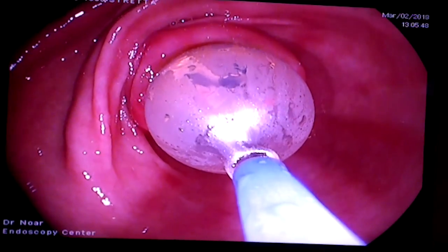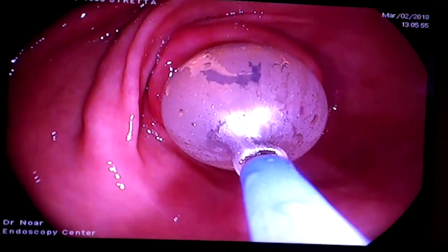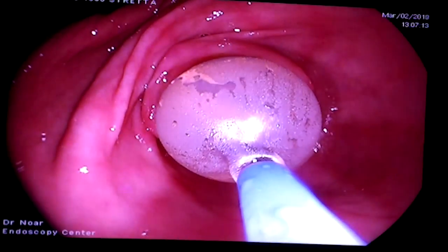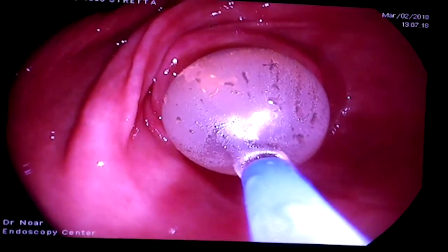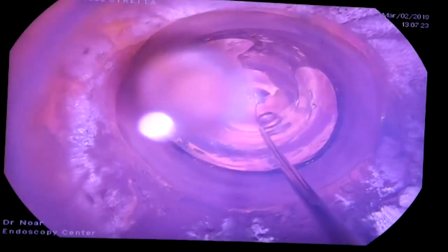I wish there was a way I could actually adjust the light, but I can't, so that's what we're going to have to deal with. This is going to be dilated for a total of two minutes. We're nearing the end of that two-minute interval.